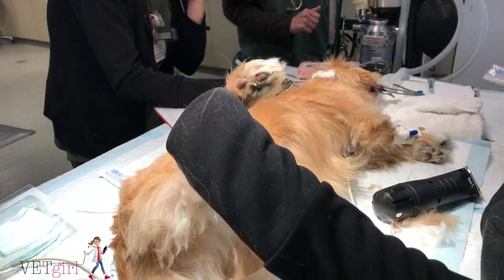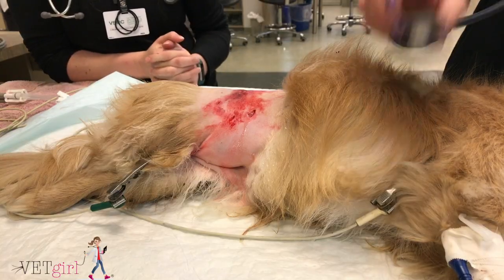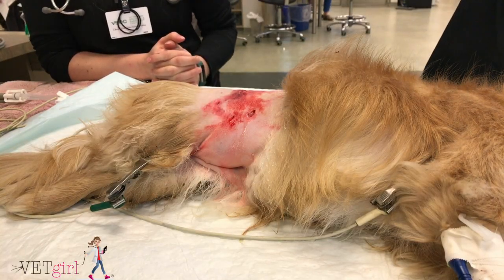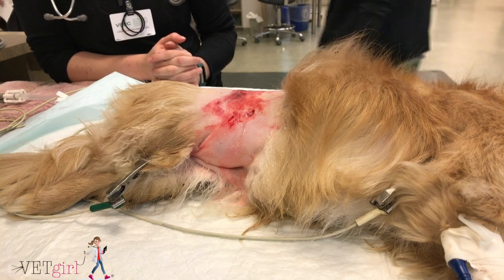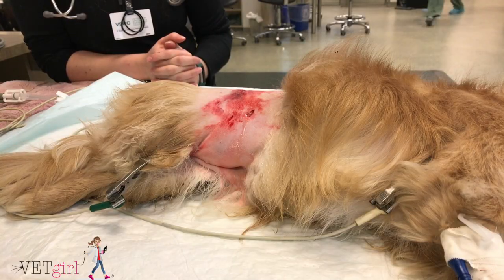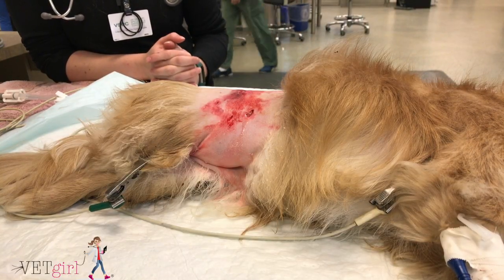For this reason, we are going to demonstrate placement of a Penrose drain, which allows passive removal of fluid via capillary action. The patient was placed under general anesthesia, and the area around the wound was clipped and prepped to promote aseptic technique and management of the wound.